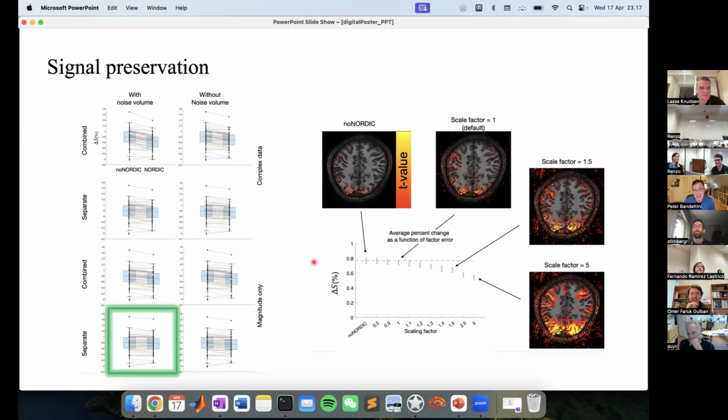Yeah, but here in this case, it's just so hard to know if it's false positives, right? Because we don't know if the white matter activation is something that we now see because we removed all this thermal noise, or is it smoothing that is being introduced, or from the gray matter, or what. That's hard to tell, I think. I think Peter was maybe suggesting something like, without the threshold, just showing the contrast, maybe next to the figure. And then you would see if it generates signal, or if it's just generating signal above the threshold.